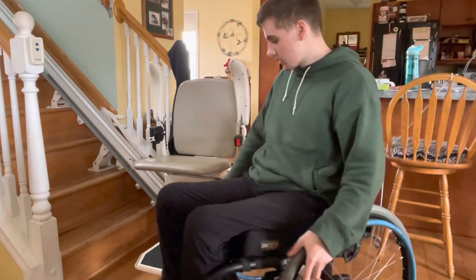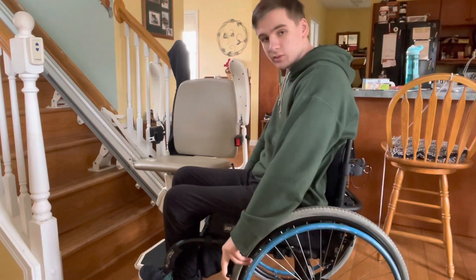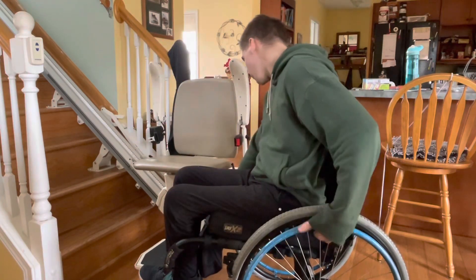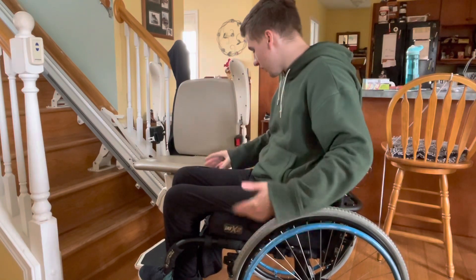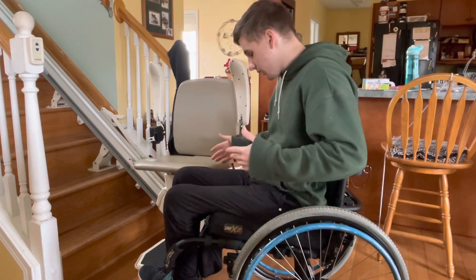When I come up to this, I get right up to it as close as I can. The little foot plate blocks my wheel from getting perfectly close to it, but I'm about this far away from it, which is not very far. Obviously you can get closer to things.